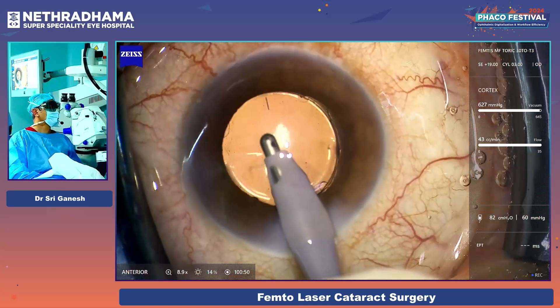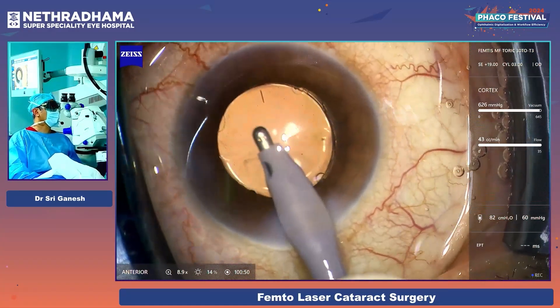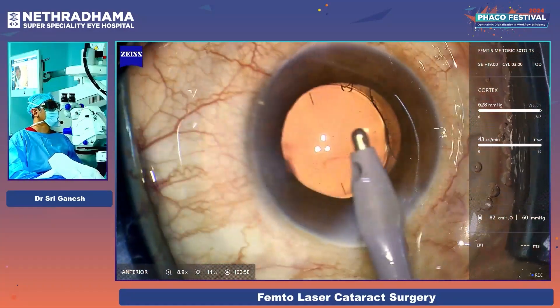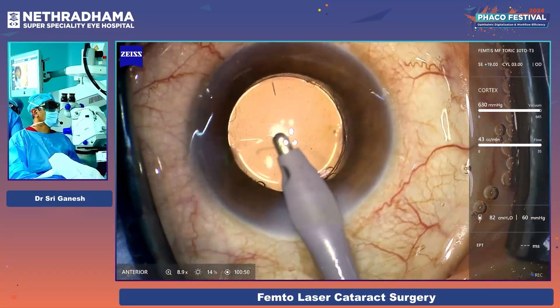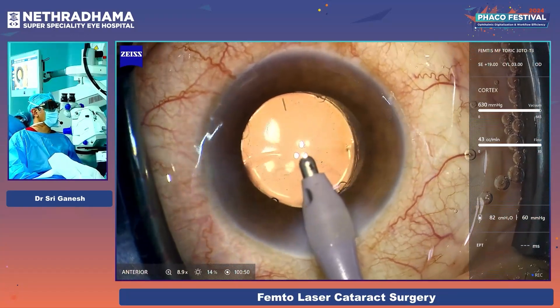What is the diameter of the optic, Dr. Srikanesh? The optic is around five millimeters. It is a smaller optic because you have to enclavate it, and that is why you need a 4.8 mm capsulorhexis.